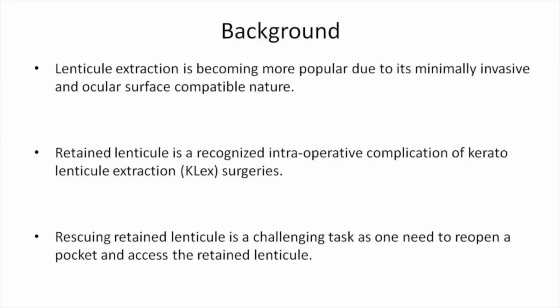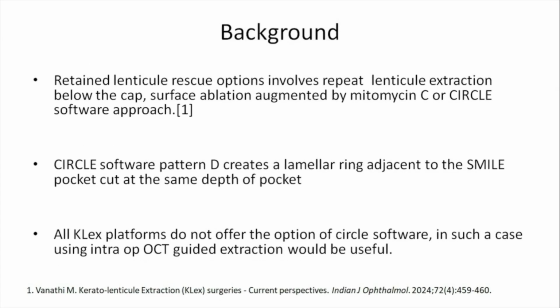Lenticule extraction is becoming more popular due to its minimally invasive and ocular surface compatible nature. Retained lenticule is a recognized intraoperative complication of keratorefractive lenticule extraction surgery. Rescuing a retained lenticule is a challenging task as one needs to reopen a pocket and access the retained lenticule. The options available are repeat lenticule extraction below the cap, surface ablation, or CIRCLE software.